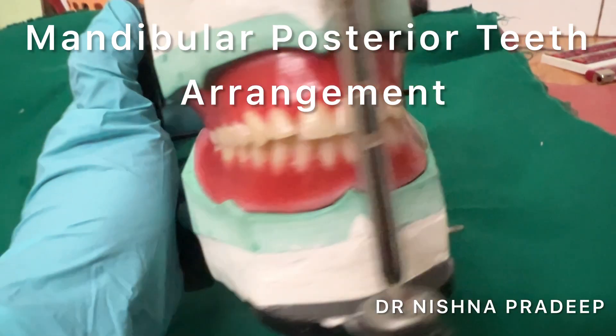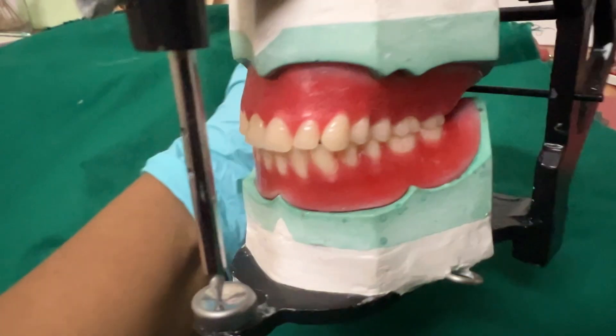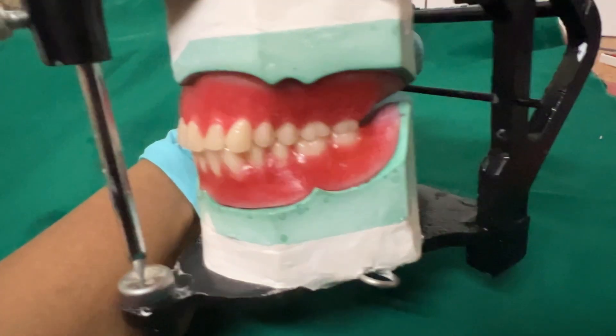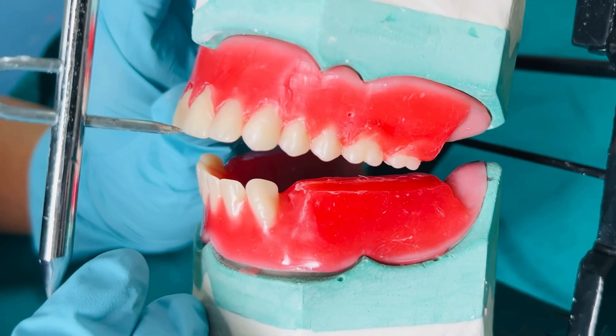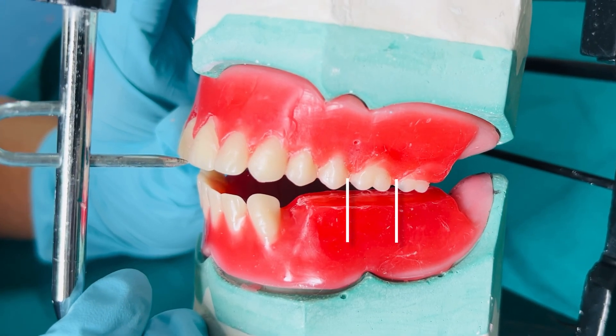Hi everyone, this video demonstrates arrangement of mandibular posterior teeth. We will be starting with a setting of the mandibular first permanent molar. To do this, start by marking the area in the wax opposing the maxillary first molar.